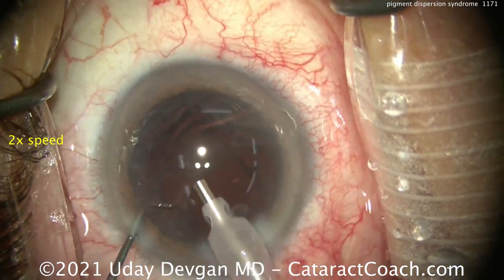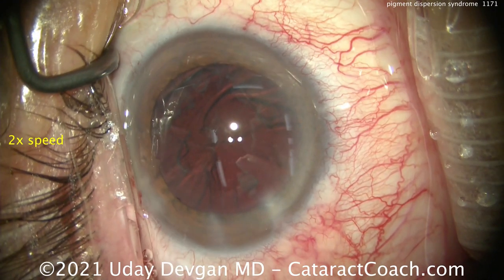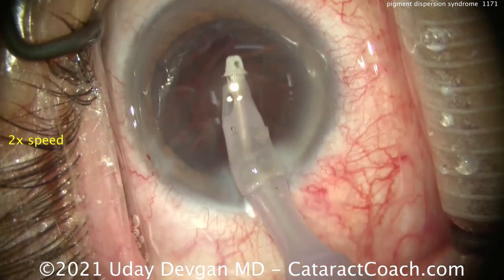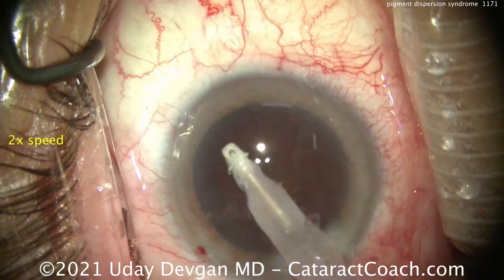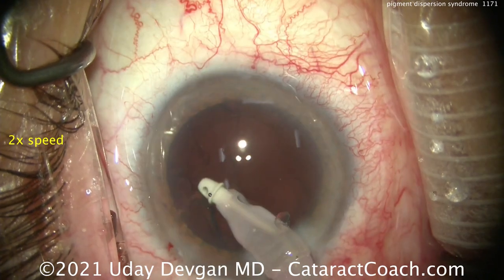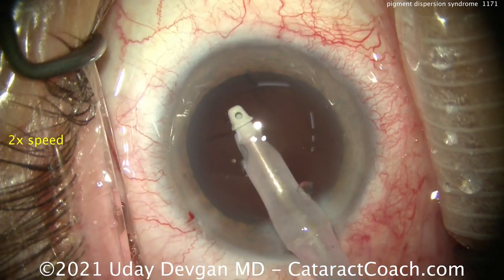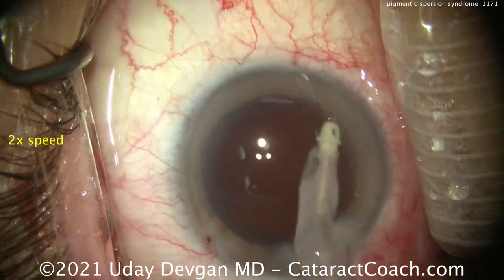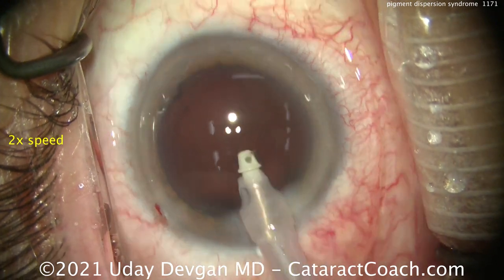In this patient, we can see the nucleus is already gone. We're going to clean up — aspirating and placing the probe right towards the angle of the eye to help aspirate out any particulate matter or pigment that's been dispersed in that area. We still want the patient to have a follow-up with a glaucoma specialist and follow up basically for the rest of his or her life.